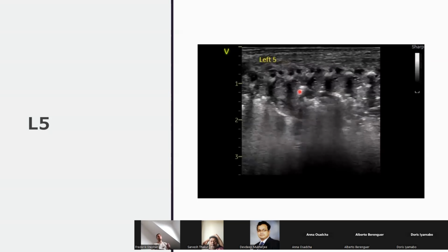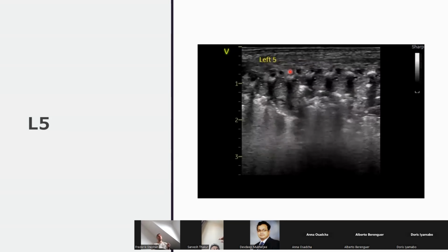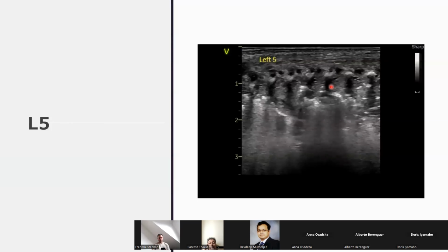You've hit the nail on the head. It can be really challenging because these dark areas that you see over here give you a really odd appearance. And to be honest, some of this is a combination of the acoustic shadow of the rib, and there's just quite significant atelectasis. Now, in the extended convex view, the acoustic shadow of the rib does not necessarily follow the rib, so it can be confusing. So a lot of what you're seeing here is atelectasis, no pleural line, with hepatization and these dark areas, and not really fractal signs. They're acoustic shadow of the rib.